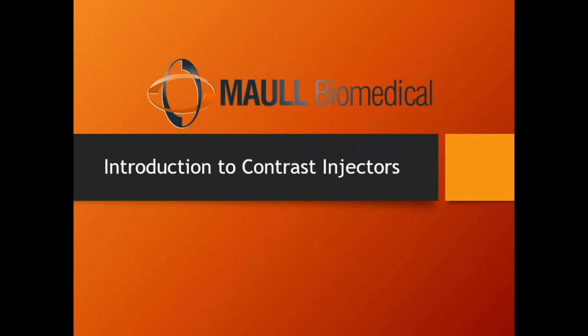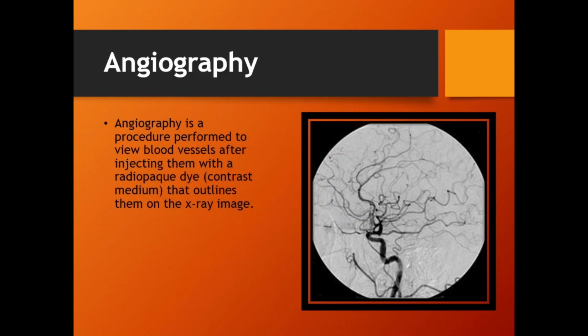Now, what I've just described to you is referred to as angiography. Angio means blood. Ography is the viewing of. So angiography is literally the viewing of blood vessels whenever you hear that term. And that's what this is, angiography, and this is a good example. This is actually the opposite example of what I was talking about. This one is a fluoroscopic image, not a radiographic image. I won't get into what that all is, but it has a white background where the body parts we're looking for are dark. It's the same thing, just flipped.